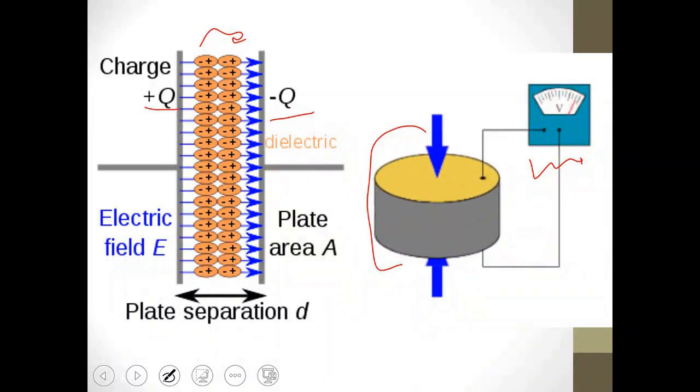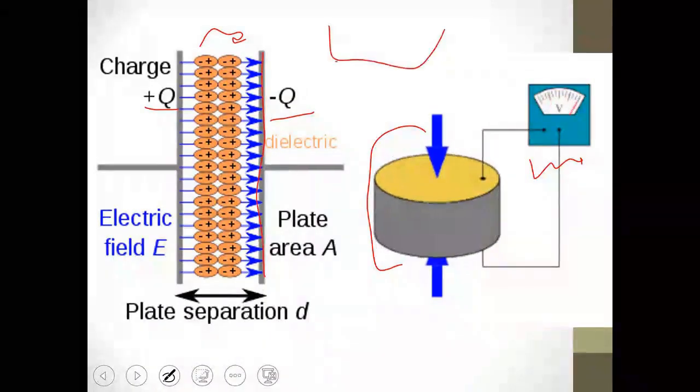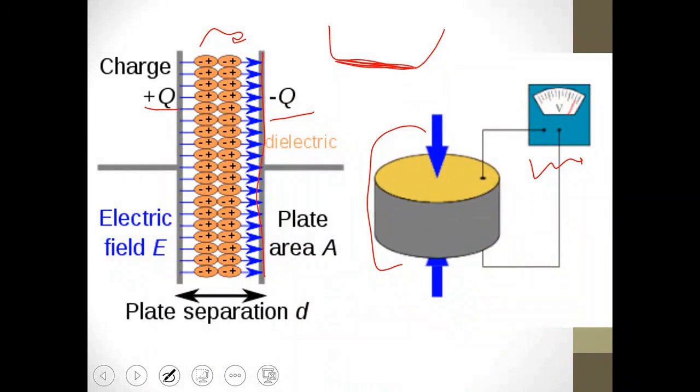This depends on the change in the orientation present in the crystal. This change in orientation compresses the surface of the crystal relative to the surface of the probe or the surface of the transducer. This pressure generates ultrasound waves that come out of the transducer, and then imaging is performed for you. So this is the production of the ultrasound pulse.